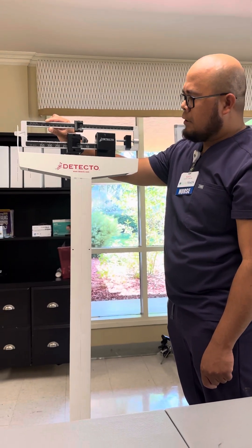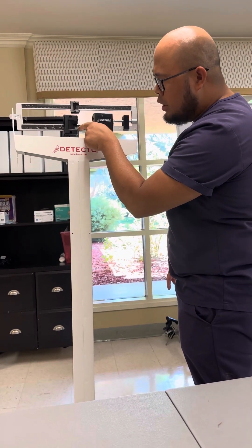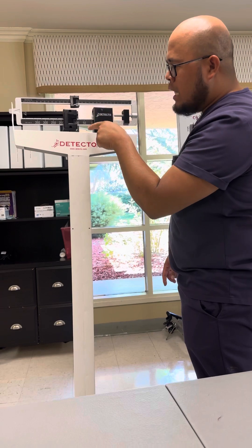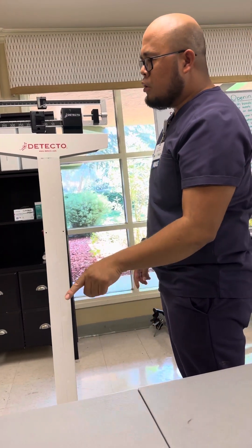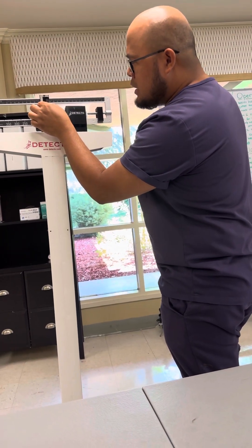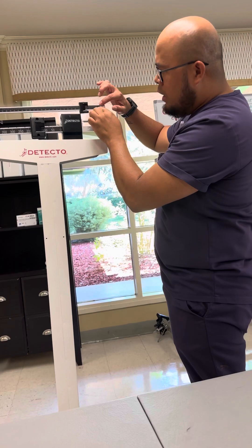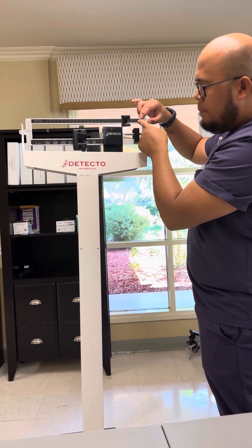So for example, the weighing scale stopped there. How much is it going to be? Look at the bottom number first — 100 — plus the one on top. 100 plus 28 equals 128 pounds. But take note, there are three small lines. Start from zero: the first line is 1 fourth, then 1 half, and then 3 fourths.